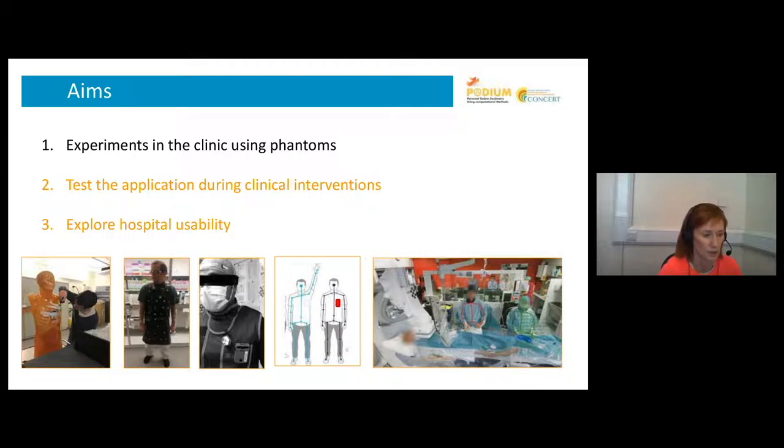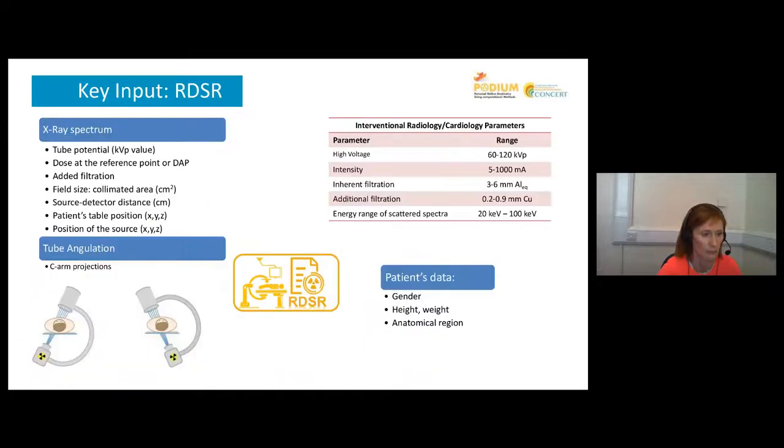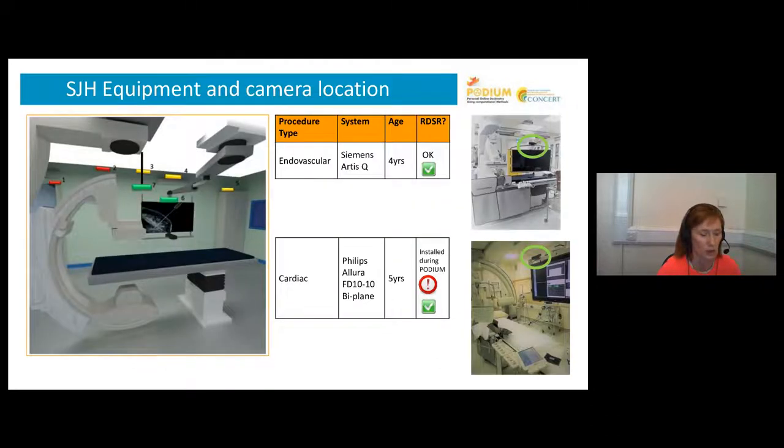In Malmo, obviously, they also did part two, the test of the application during clinical interventions. And we did the same in St. James's, and we looked in good detail at the hospital usability. It was mentioned by Maria Moore that the RDSR, the radiation dose structured report from the interventional X-ray system, is a really key part of PODIUM. So one of the first things that we had to do, when setting it up in St. James's, was decide which rooms to use and where to locate the cameras.